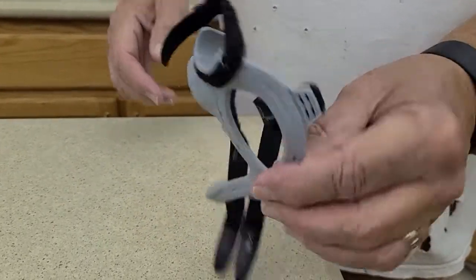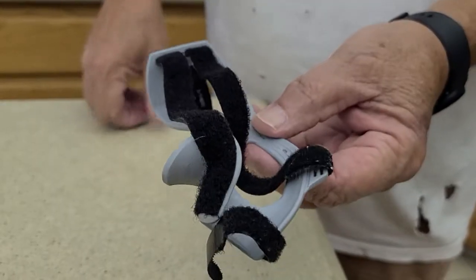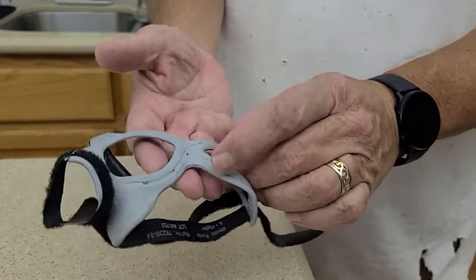This is the hand brace for your thumb. These straps here go around the back of your wrist, and this part fits in the palm of your hand.